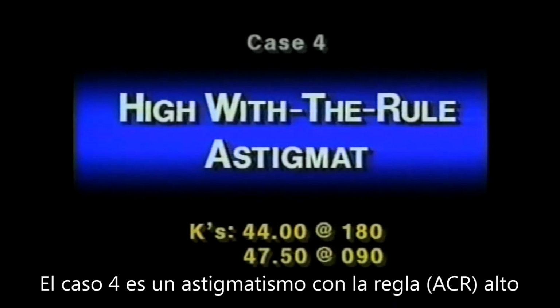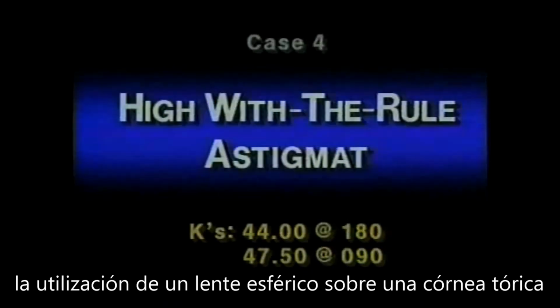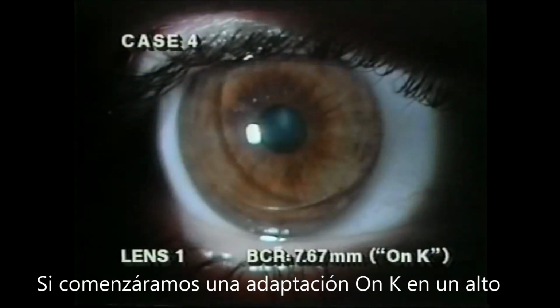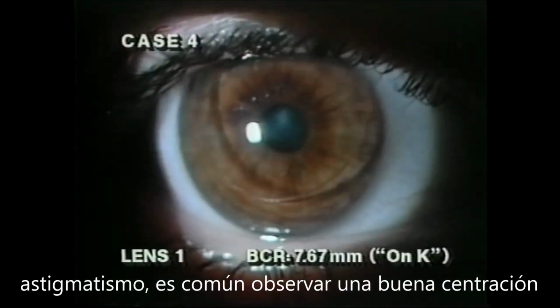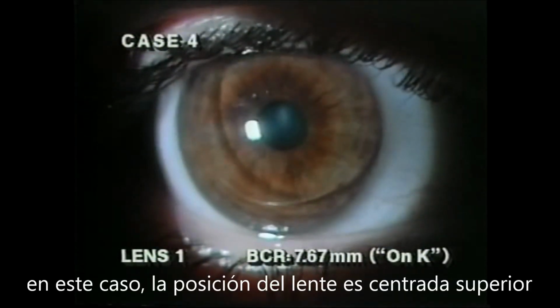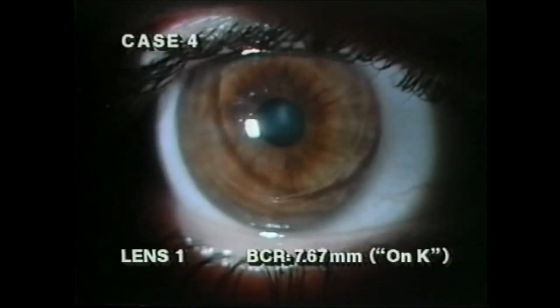Case 4 involves fitting the high with-the-rule corneal astigmat. The application of spherical versus bitoric lens designs will be presented. It's typical for a lens fit on a high astigmat to decenter inferiorly. In this case, the lens positions superior central and presents a seemingly acceptable lens to cornea fitting relationship.